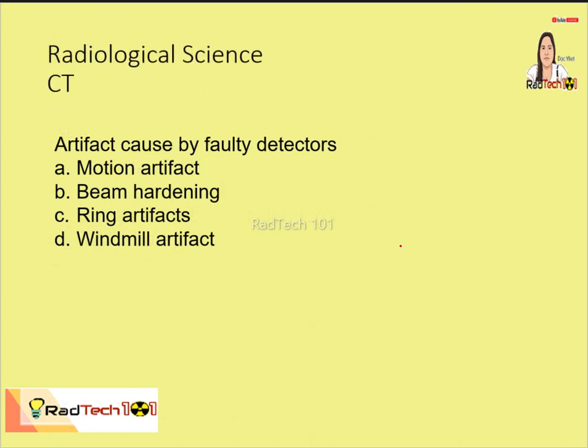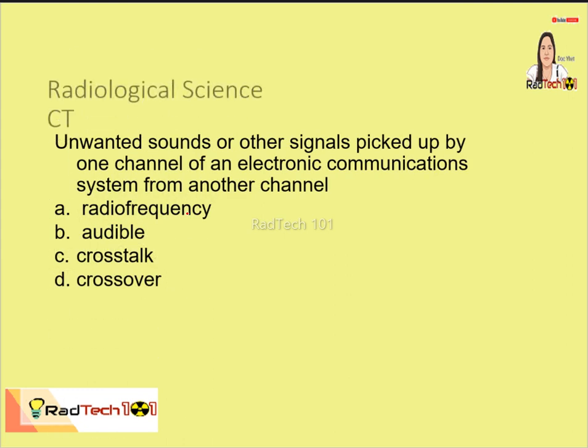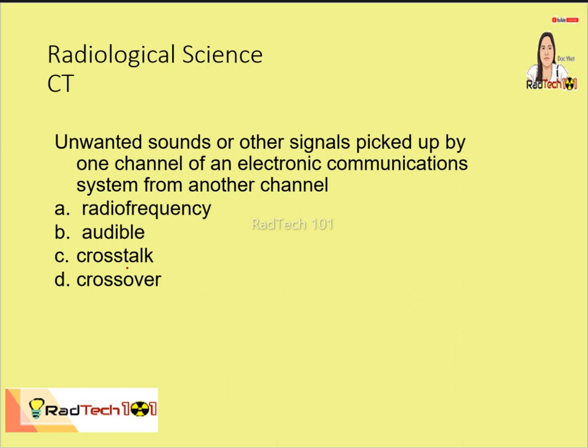Next, artifact caused by faulty detectors. So, nangyayari siya kapag may problema sa detectors natin. So, those are ring artifacts. Next, unwanted sounds or unwanted signals picked up by one channel of an electronic communication systems from another channel. So, basta unwanted siya from one channel to another. So, crosstalk is crosstalk.